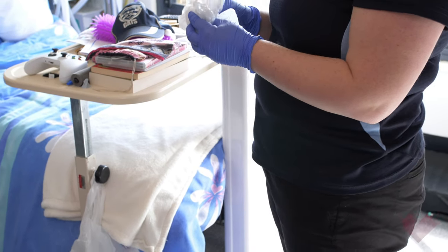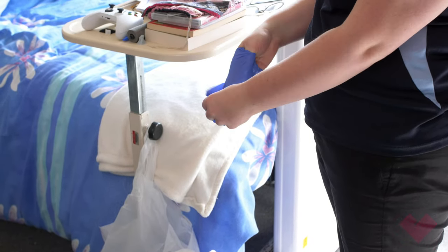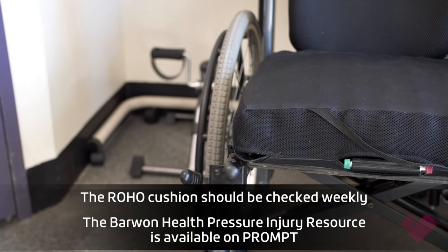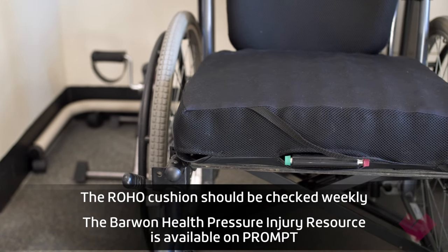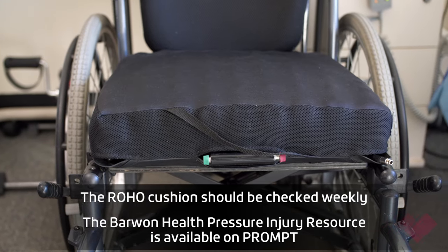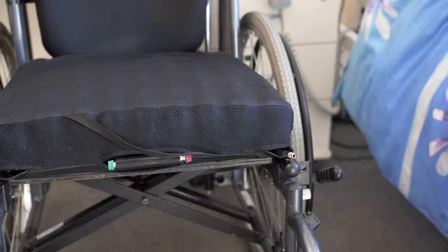Ensure you dispose of the plastic bag and gloves as you typically would when completing hand hygiene. This process of correctly setting up a Roho cushion applies to both standing transfer and hoist transfer. Regular checks should be done to ensure there is still sufficient air between the ischial tuberosity and the chair.